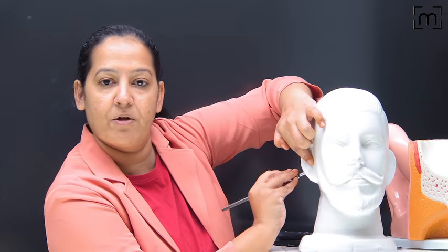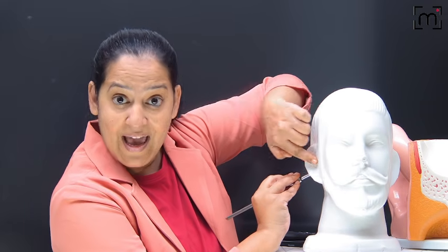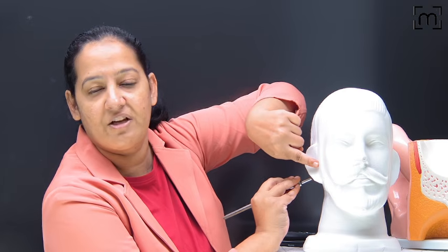So first I will close the tragus. I'm closing the tragus of my patient over here, activating the fork and keeping it on the mastoid. The external meatus is occluded with the tragus. As soon as the patient says yes, it's stopped, I close my own tragus and keep it here. So both of us have the tragus closed, the meatus closed. That is the most important thing, and that will differentiate this test from the next test. I hope you all got it.